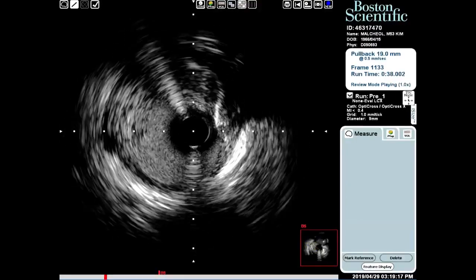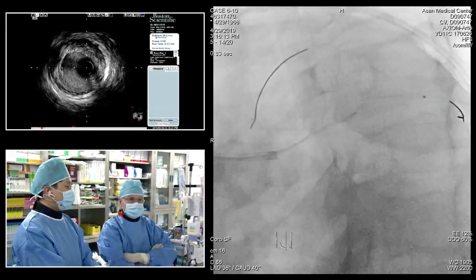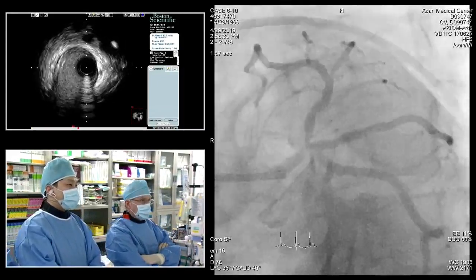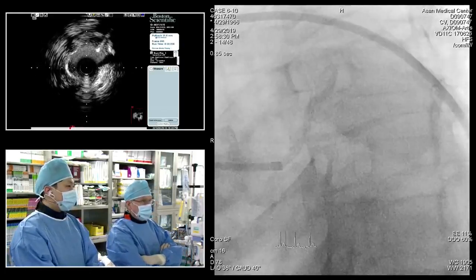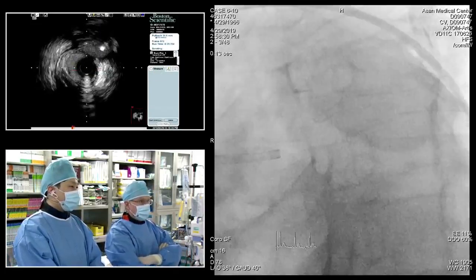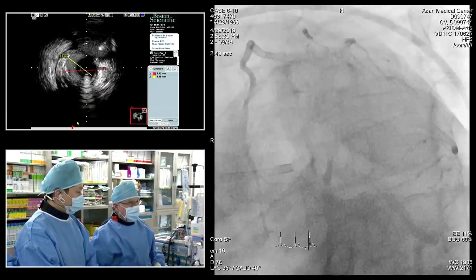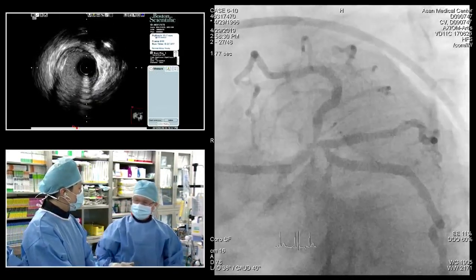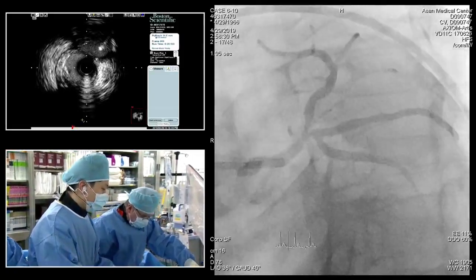So in my practice, I don't think this baseline IVUS was really necessary. We don't really acquire any new information besides the angio. I would have considered the LAD 3.5, the left main 4.0. I think the circumflex was clearly focal from the angio as well. So the plan is to predilate LAD and left main with a 3.5 non-compliant balloon and be provisional on the circumflex after stenting the left main toward the LAD.